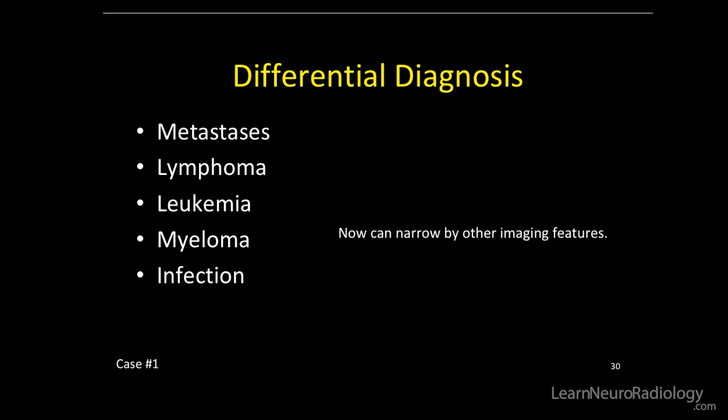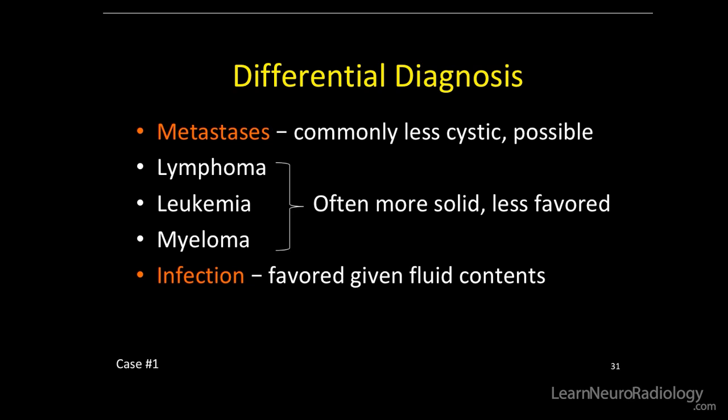We can now narrow this down by other imaging features. Lymphoma, leukemia, and myeloma usually show a more solid enhancement pattern, but this one had a peripheral enhancement pattern. Metastasis is commonly less cystic, but possible. We're going to favor infection for this case, given the peripheral enhancement and fluid contents.